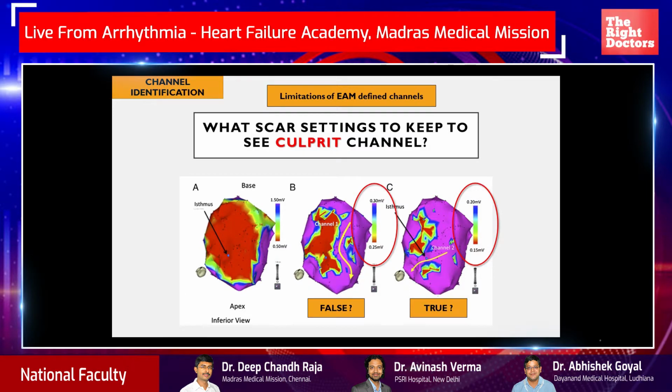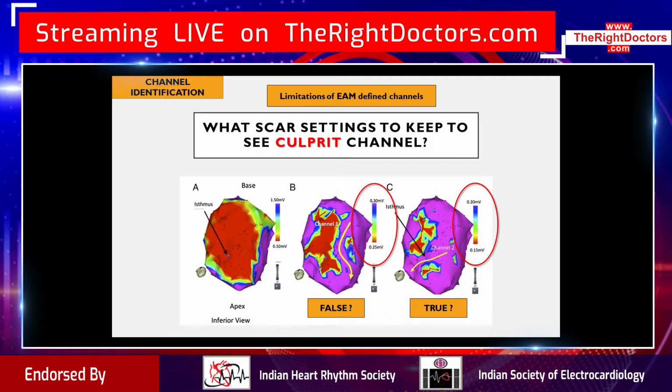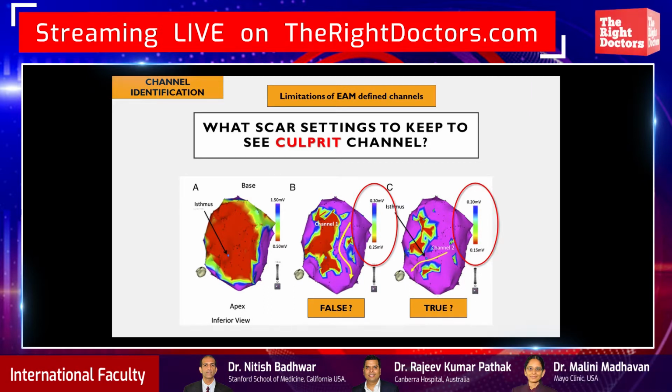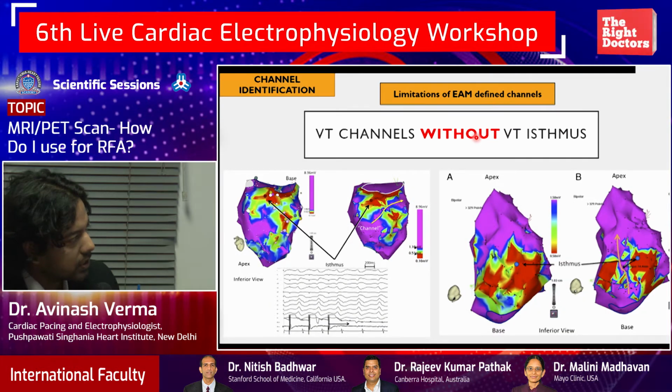So this is the problem: the scars show you channels, but you don't know which is the culprit channel. Culprit channels reside in the area which has a heterogeneous critical mass, above which the circuit can form and below which the circuit cannot form. We'll talk about that critical mass. So what are the other drawbacks?